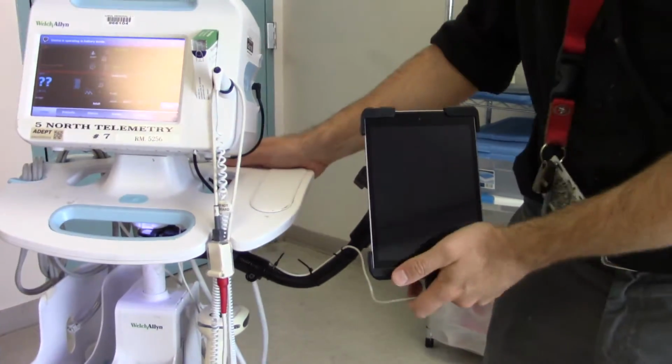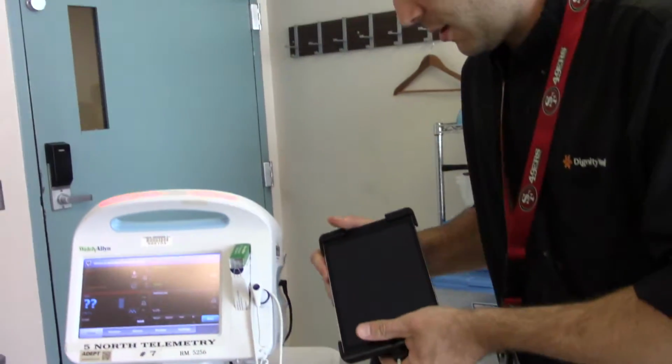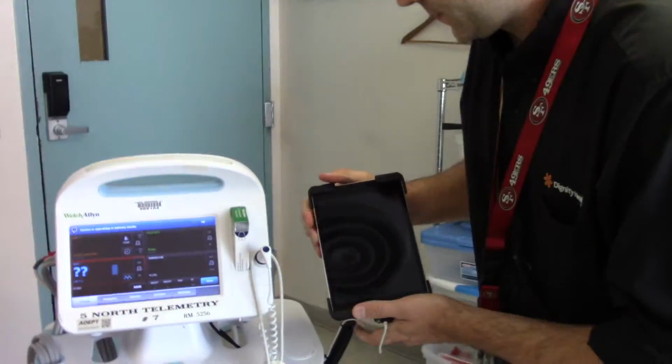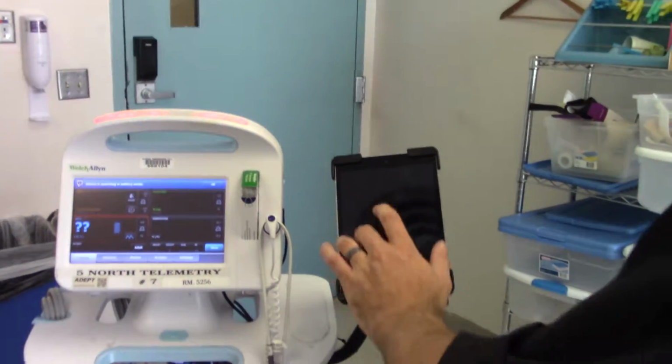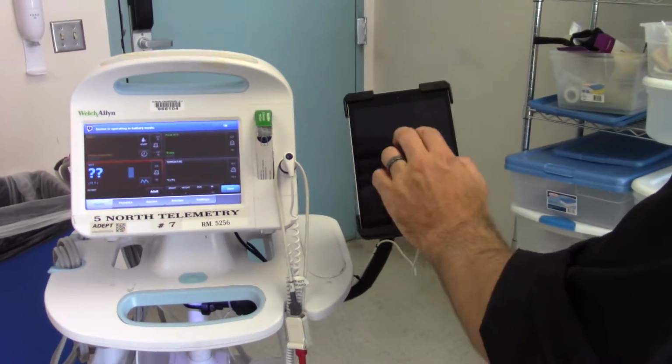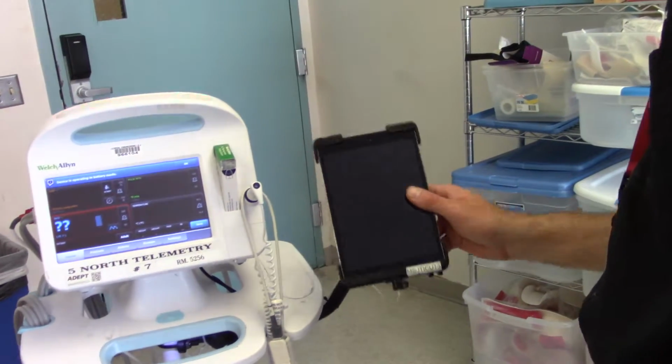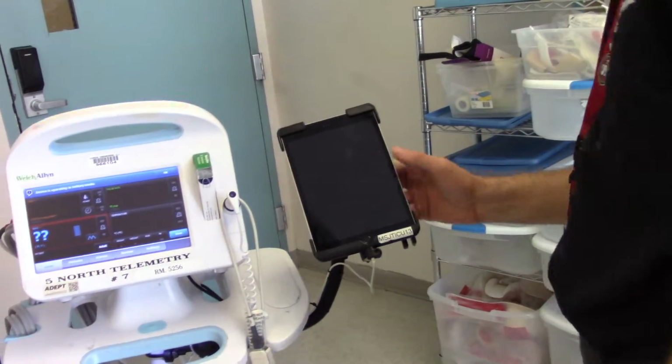So is that about the right height? This is probably kind of low. That's a little low. You kind of want it nearly parallel with the Welch Allyn screen. You're going to want it about parallel, and being rigid would help because you're tapping on the device, you're using the device, and that's also part of the vibrations weakening that ball joint.